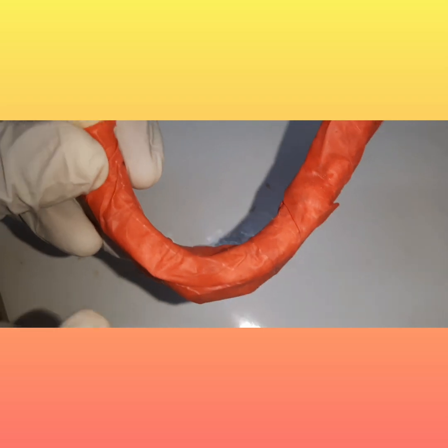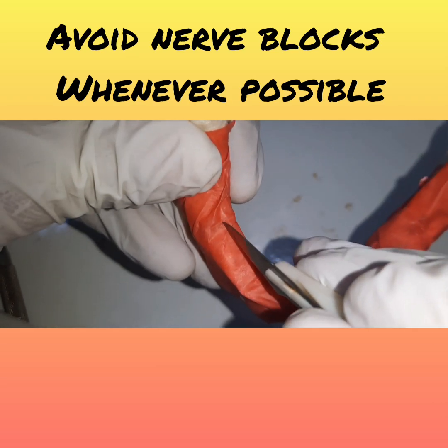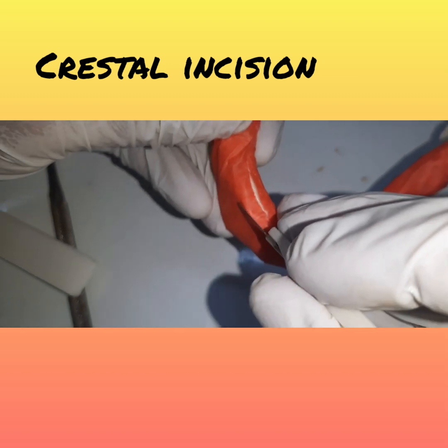Now for that you will be using a BP blade. You will be making a crestal incision here, just placing an incision like this. Either the incision can be placed in the center of the crest, or slightly labially to the crest.